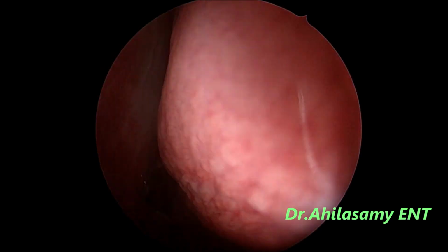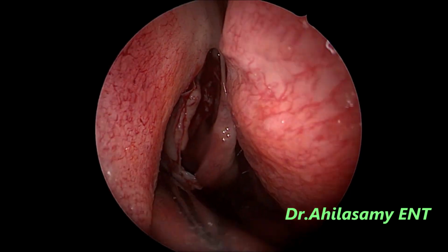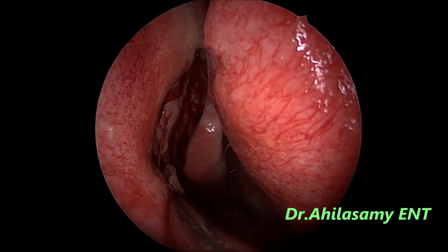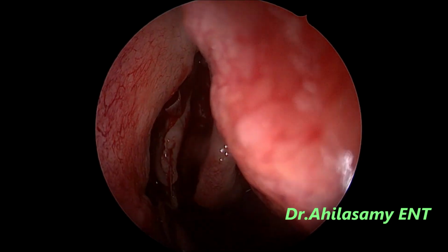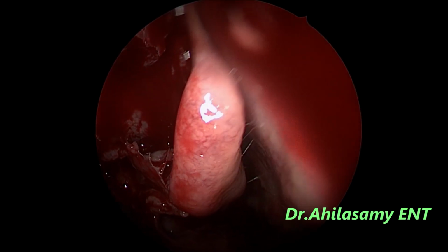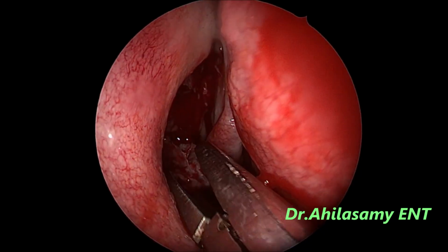I am using scissors to cut the upper and lower end of the uncinate. Of course, this is an edited video. I have edited it from around 55 minutes to around maybe 22 minutes. But the whole quality will be like an unedited video.